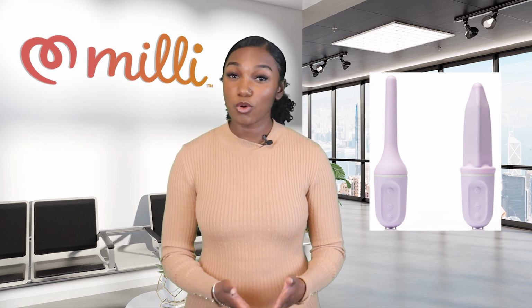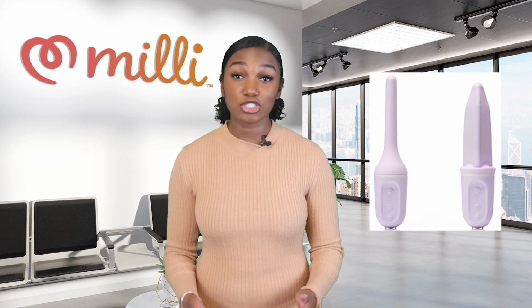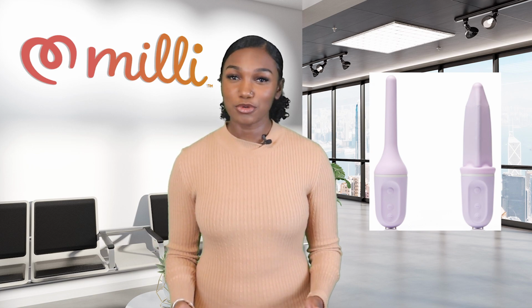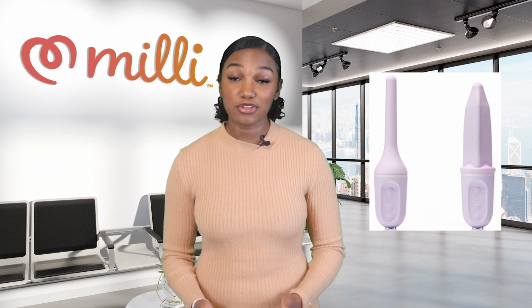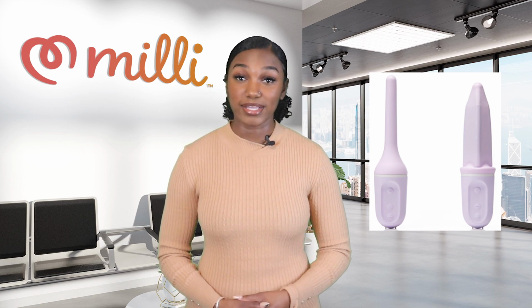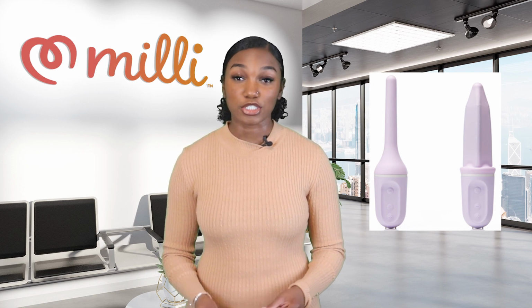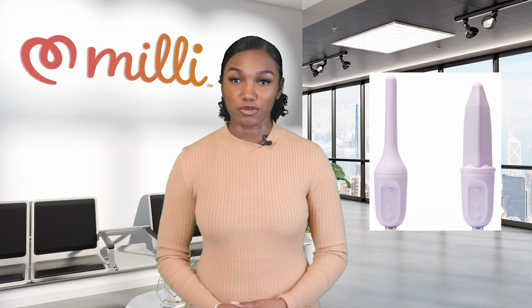As you progress towards greater diameters, you should note that dilation setting so you can track your progress. When you get to a point where you cannot expand the wand any further without experiencing pain, note the setting and then either remove the device in its expanded state or press the minus button and allow the wand to contract before withdrawing it from your vagina.